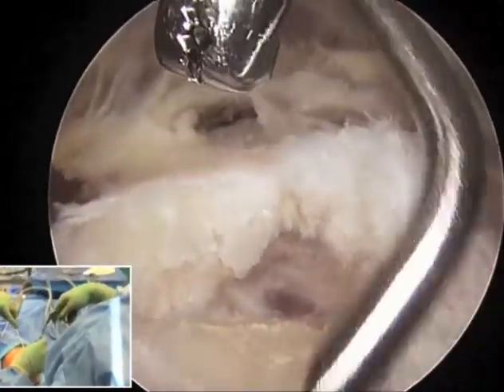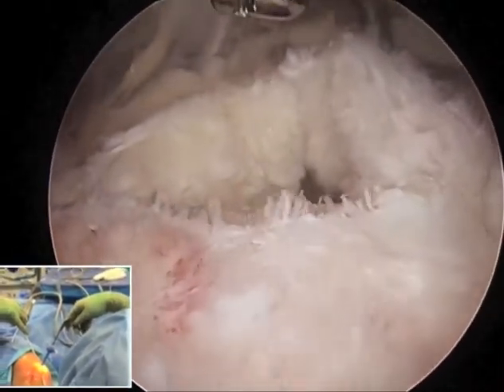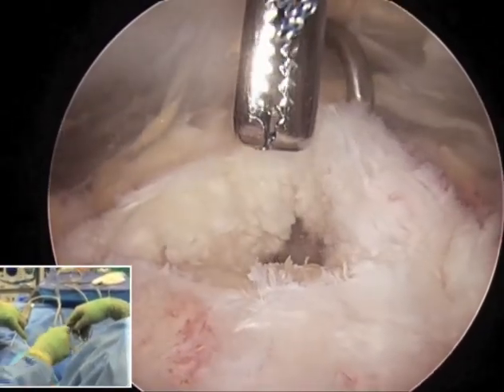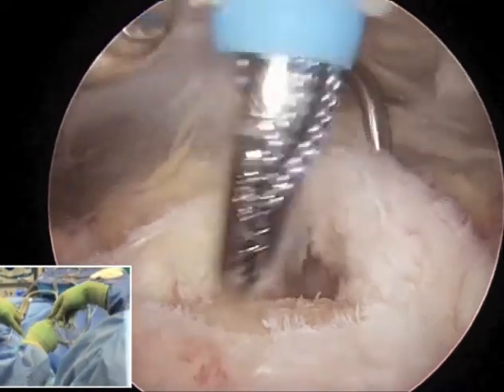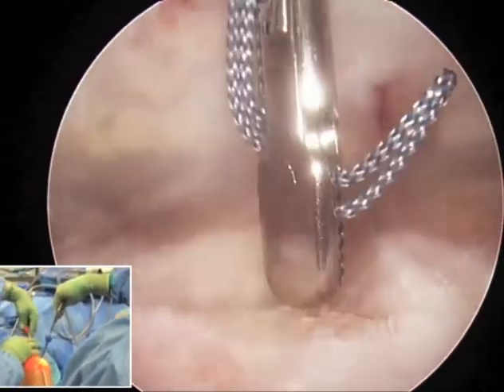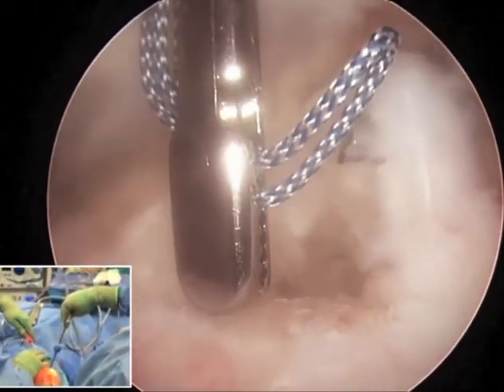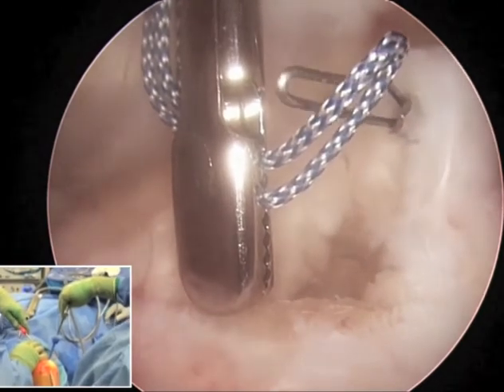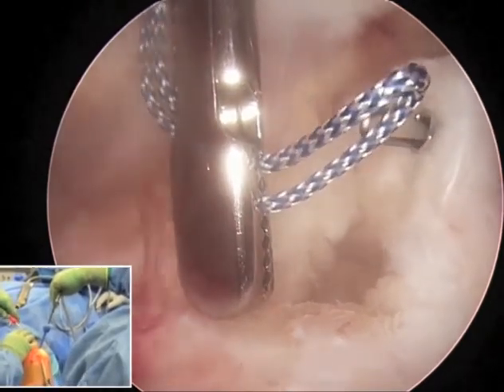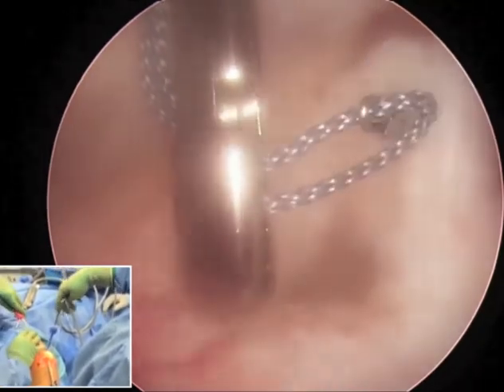Through a more proximal portal we bring a retrograde retriever in, penetrate the triceps in a central fashion, come back under the tendon, go into the joint into the olecranon fossa, and then out through the edge of the tendon and retrieve a suture that we hand to ourselves. In this case this is a number two ortho cord suture.